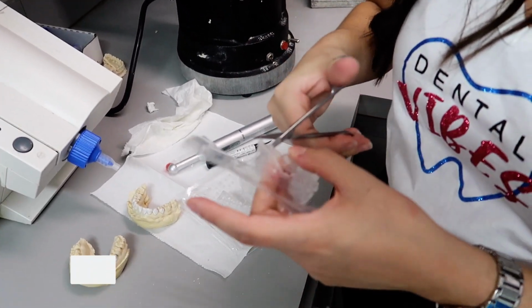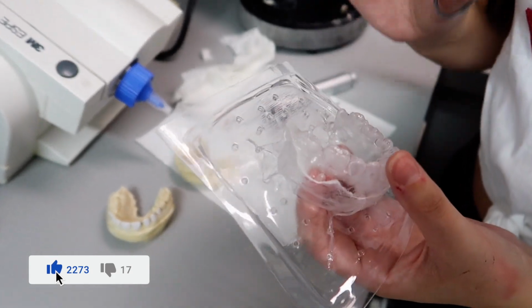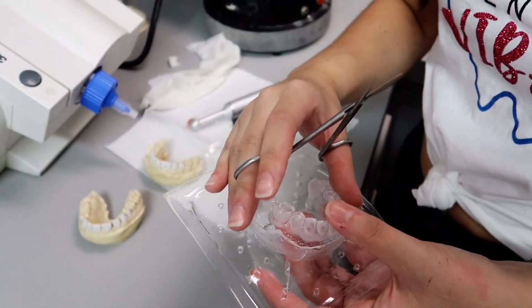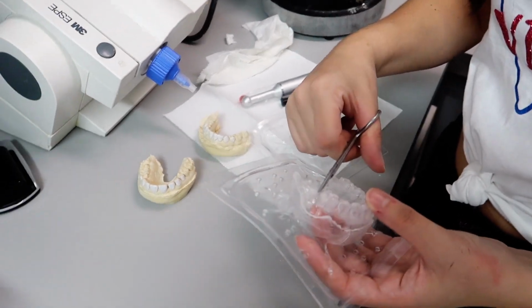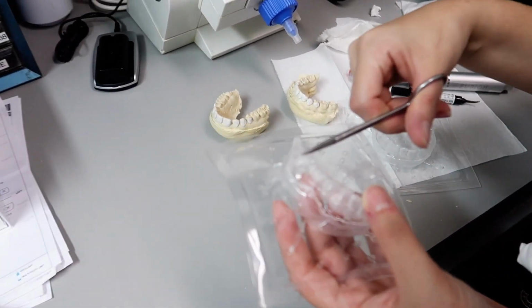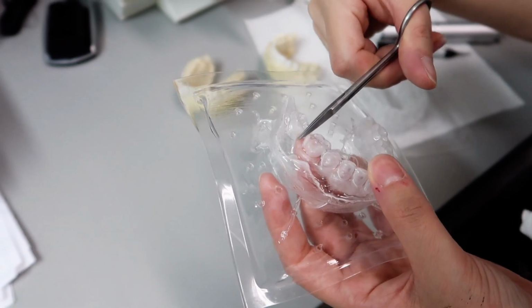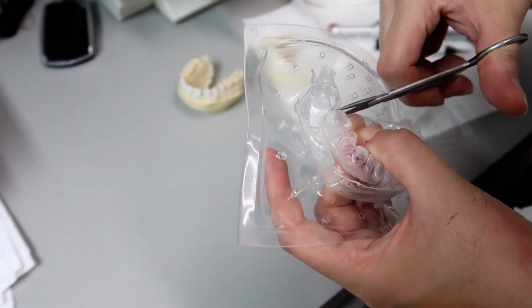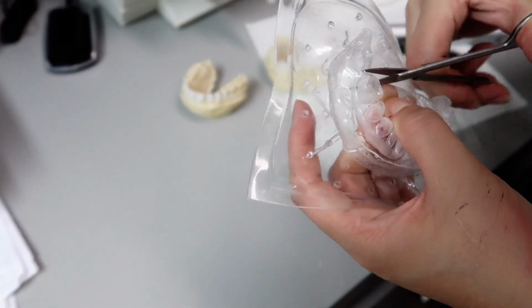First thing, I want to get it out of here so I don't have to be super precise. Are you doing a rough cut basically at first? A rough cut at first. Obviously this is my bleaching tray. I'm missing a tooth here, and my wisdom tooth shifted forward quite a bit. Obviously I'm not going to bleach my wisdom tooth, so I'm going to go ahead and cut it right here.